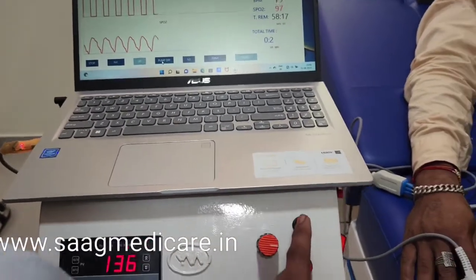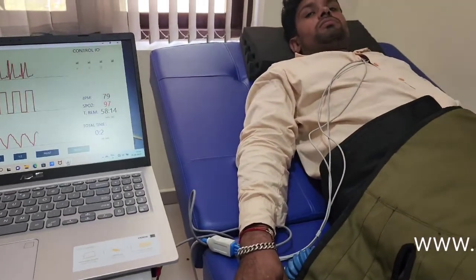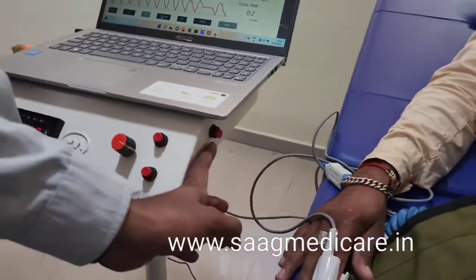These are the head up and head down buttons, and on the side there is a reset button and a power on button.